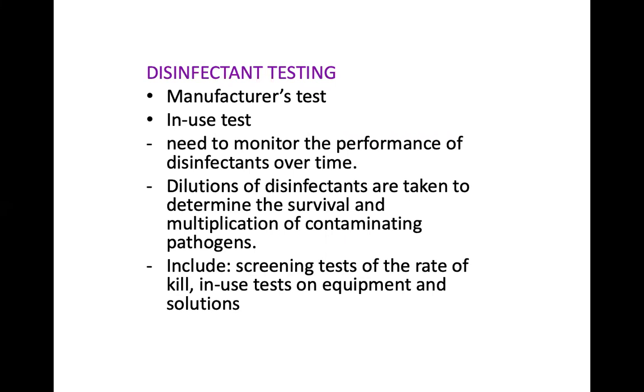In theater, in the station where the nurses are doing triage, taking temperatures when the patients walk in, how often do we need to change those chemical disinfectants? How should we store them? This is the in-use test. All in-use tests must be determined by the infection control team.